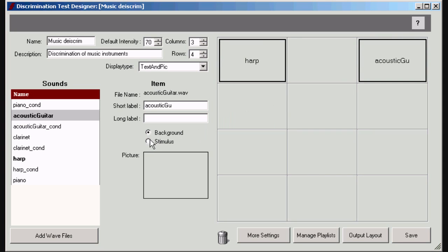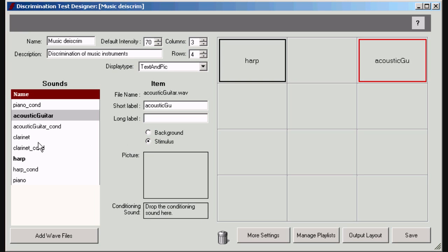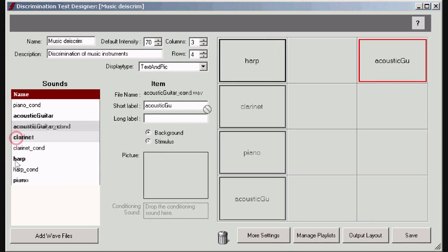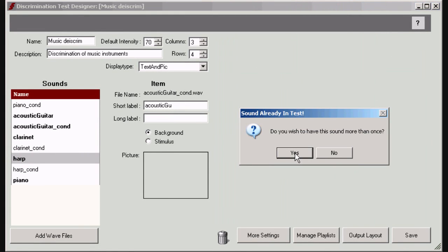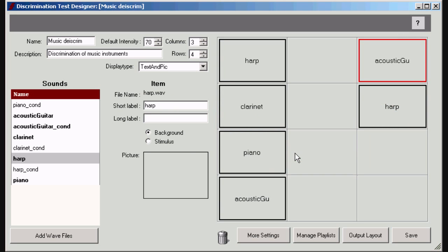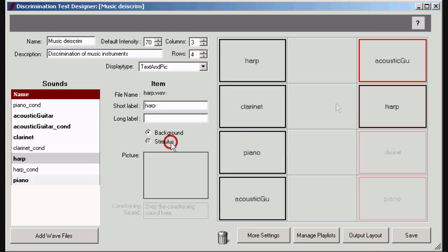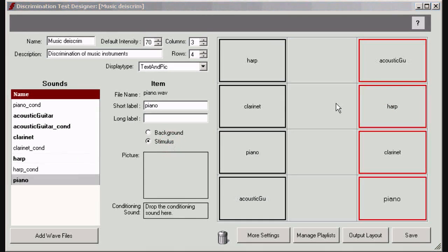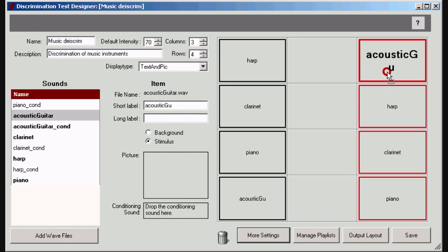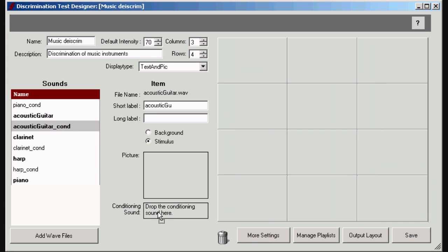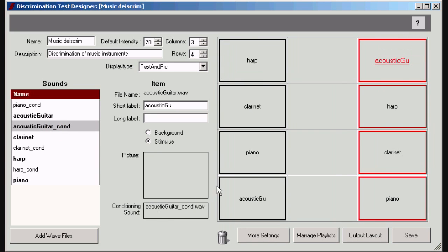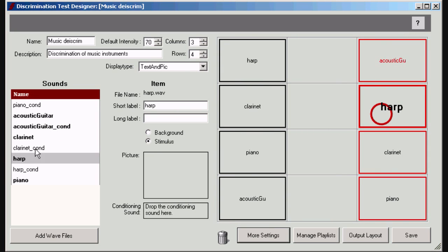Define whether this sound is going to be used as background or stimulus sound in the oddity paradigm. The same sound can be used more than once. A stimulus sound can come with a conditioning sound. This is another sound which is presented during the conditioning mode. It is often very similar to but more salient than the stimulus sound.